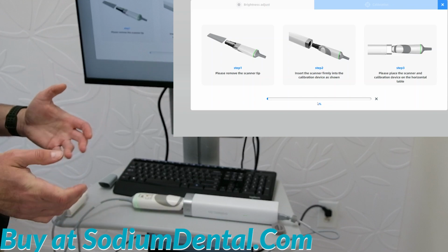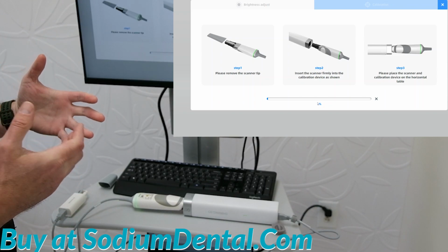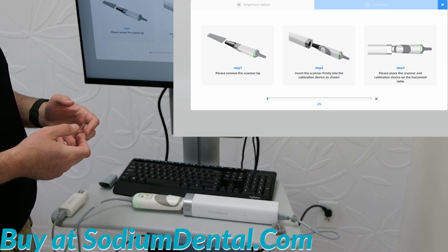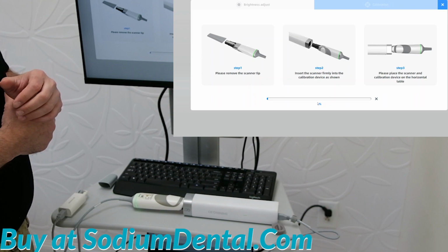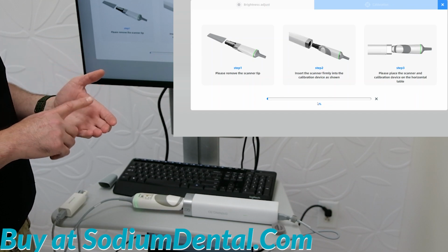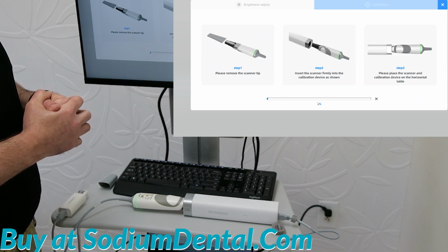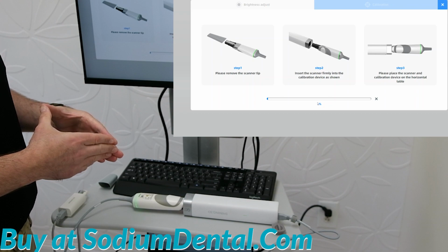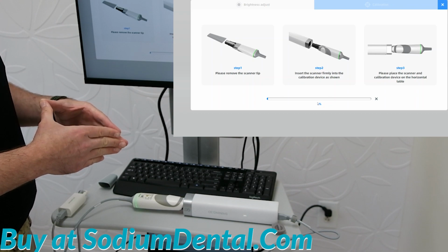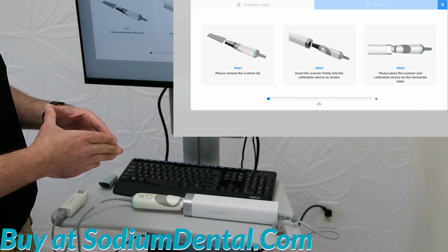Calibration will take a few minutes. This will be something you want to do with your scanner within every 30 days. This means that you'll get the highest accuracy for your intraoral scans. Also, you'll notice that it significantly increases the speed of your scanning. When the scanner is out of calibration, it will have a great deal of difficulty scanning.